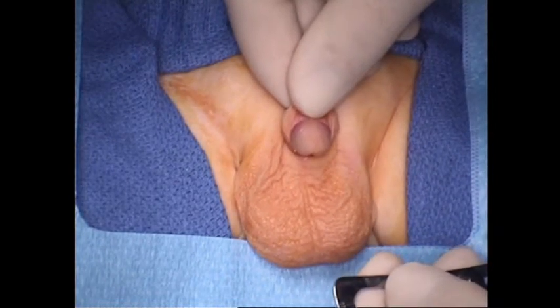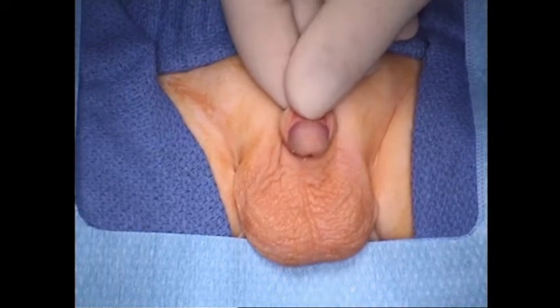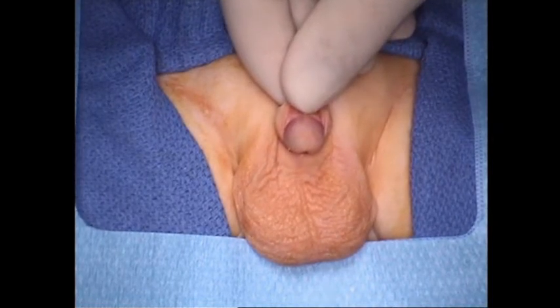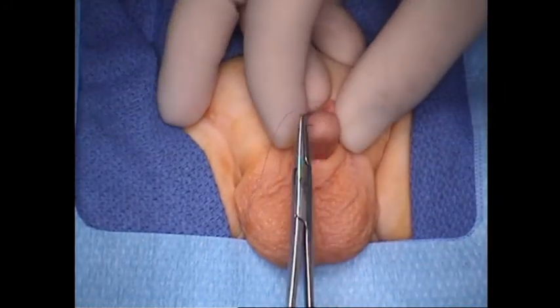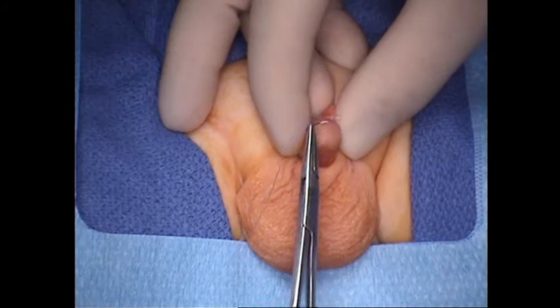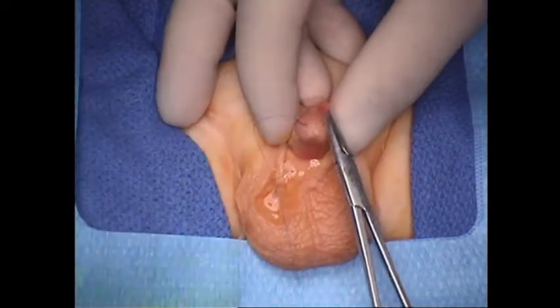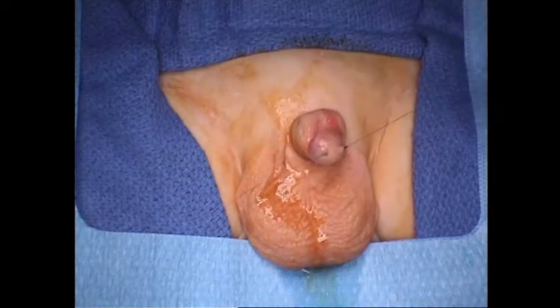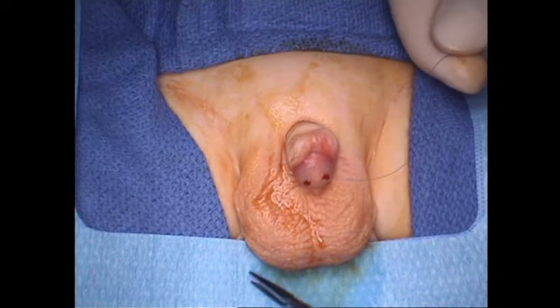So we always start off the case measuring the glans. In this case, it measures 13 millimeters. That's right about average for a patient with proximal hypospadias. Our average was 12.8 millimeters. And we use the calipers at the beginning of the case to document that because it changes our glans dissection later in the case depending on what that measurement is.